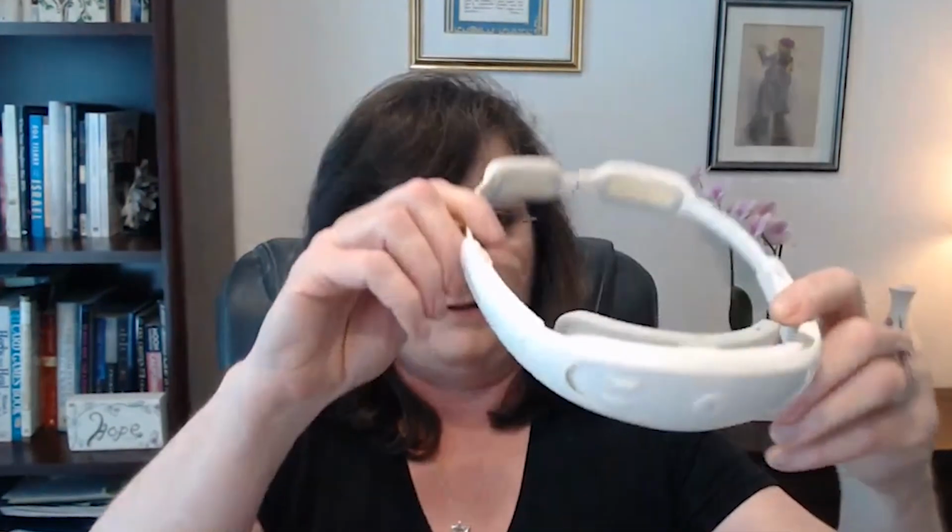The 4th device is the Relivion MG. So if you have this, it may look a little bit different because you may have a nasal thing here that actually supports it on your nose. I don't like it because it triggers pain for me. So you put it around your head like this. This device stimulates the trigeminal and the occipital nerve. It's called a brain neuromodulation device, and it is FDA cleared for acute treatment, but it is also in clinical trials for preventive treatment. And if you get this device on the app, you do have the option to try it for preventive treatment as long as your doctor has prescribed it in that way, which would be an off-label prescription, but some people are doing that. So just to let you know.